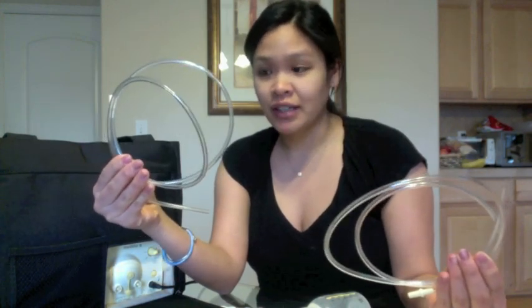When you get your pack the first time, you want to boil everything to make sure you disinfect everything, get all the chemicals off. The tubes that come with them, you get 2 sets because you have 2 boobs. These do not need to be boiled or ever sanitized. They should never get anything inside of them. This is not going to touch the baby's mouth at all. Nothing that goes through it is going to get ingested by the babies. So this stuff does not need to be sanitized. You can just put these off to the side when you're ready to use it.